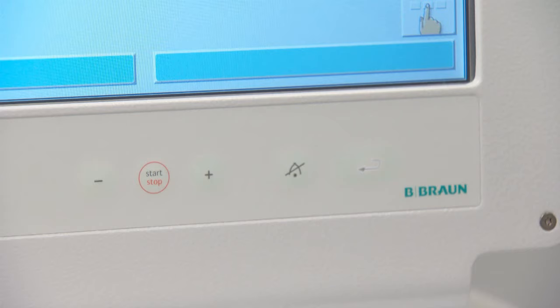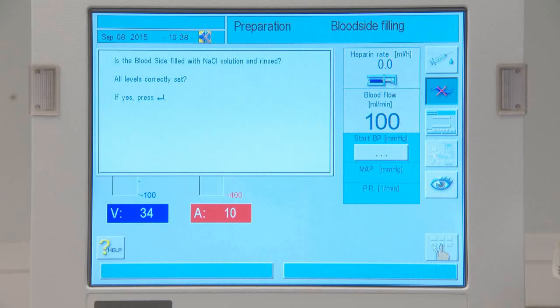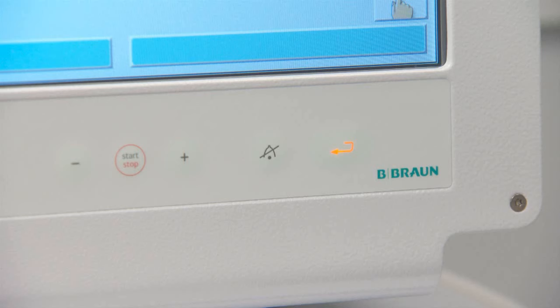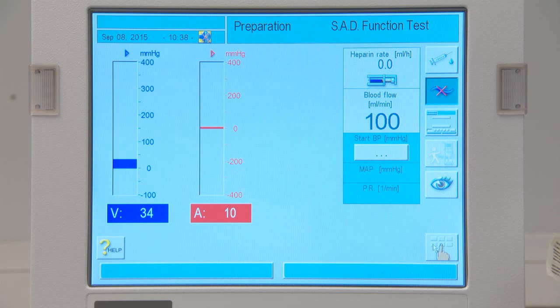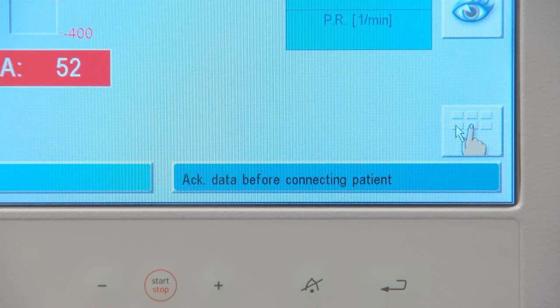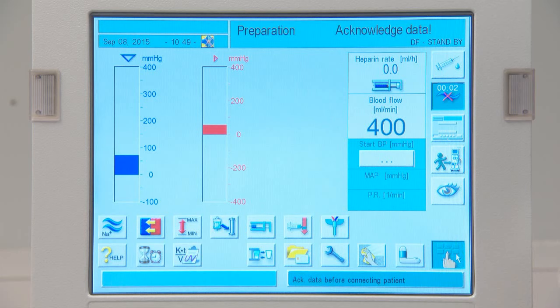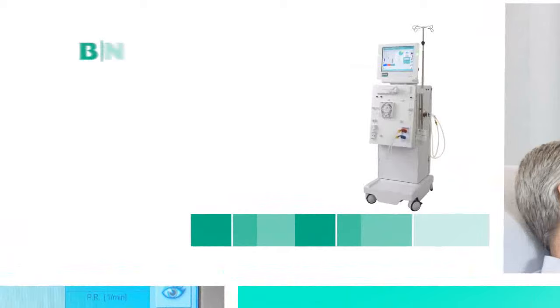Restart the blood pump. Fill the venous drip chamber completely. Press the Enter key when directed to begin the final blood side tests. Setup and prime are complete. The rinsing program will automatically begin and the icon to initiate treatment will be available. Enter prescription data and initiate therapy.